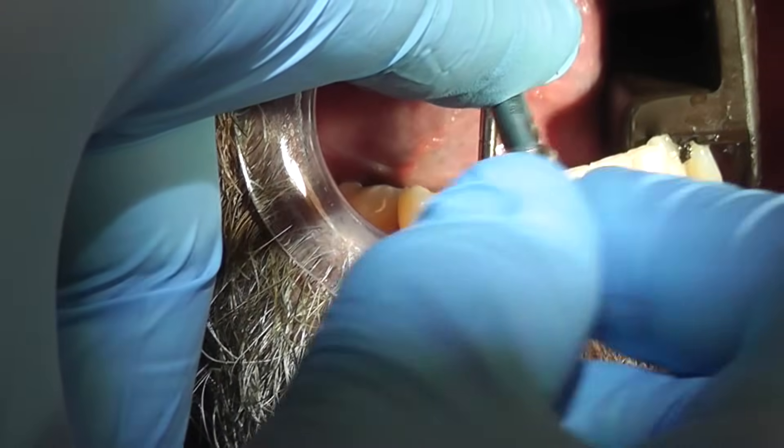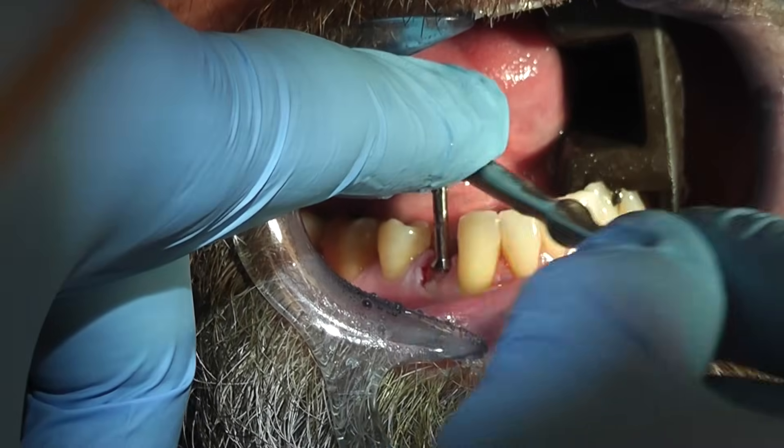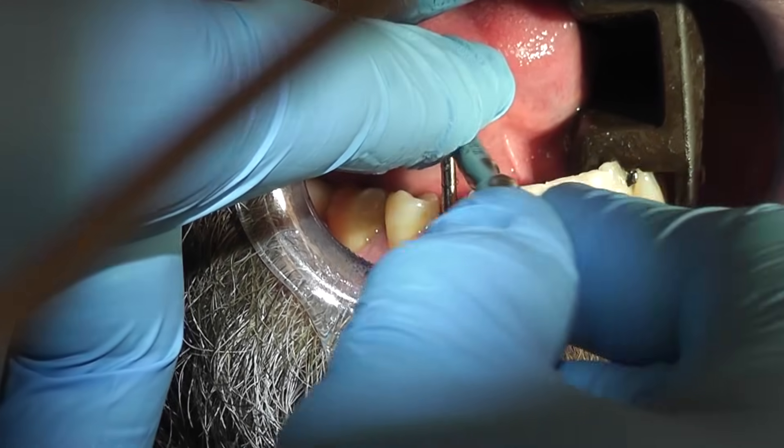Use the ratchet to place the selected extract screw in the root. Place one finger on the extract screw head to stabilize the screw and turn the extract ratchet clockwise. Placement of the Easy Extract screw is completed when the screw thread is fully inserted into the root to the shoulder.